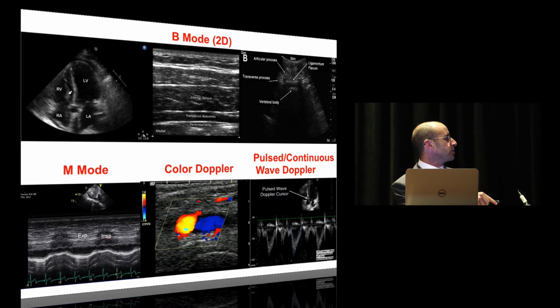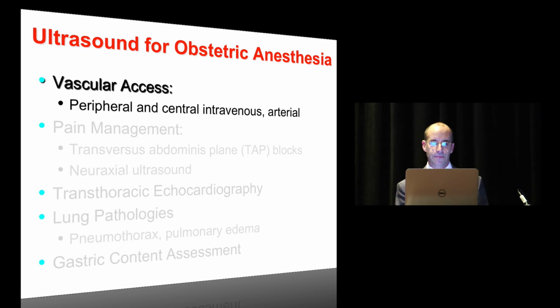Either you can do a pulsed or a continuous wave. It's a slice through and allows you to appreciate flow patterns in either a specific area or over a bigger dynamic range. So Ed Riley covered vascular access very briefly.